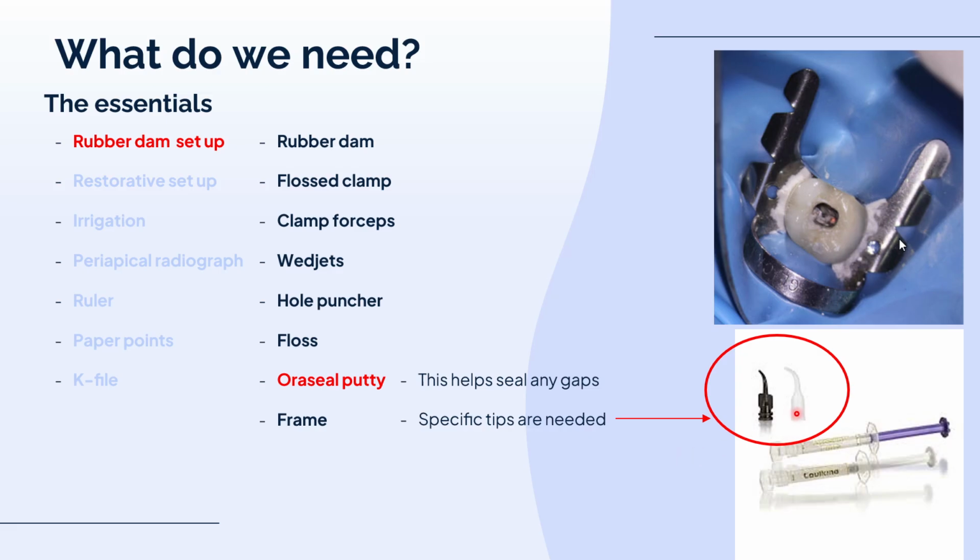Okay, there are some specific tips that go with this because this is quite thick, so do not put flowable tips on there. The metal tips. You need these special tips here, otherwise the dentist can't squeeze it through. Okay, so look at it before you give it to the dentist.